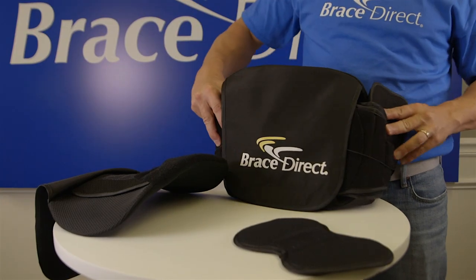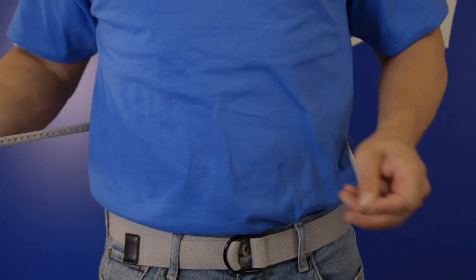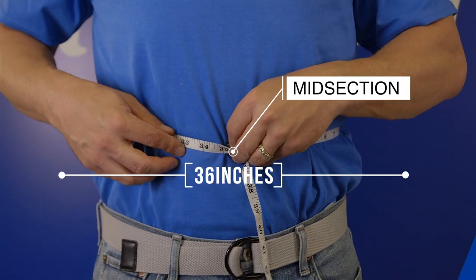The brace comes as an adjustable universal sizing, fitting waist sizes 23 to 60 inches. Measure the circumference around your midsection at your belly button to confirm if the brace will fit.